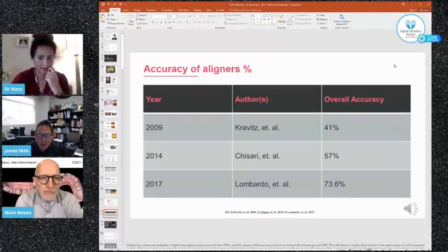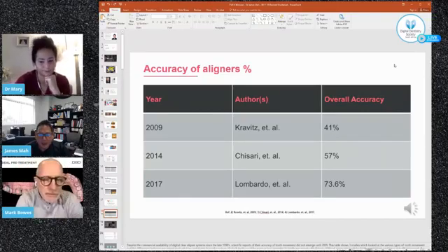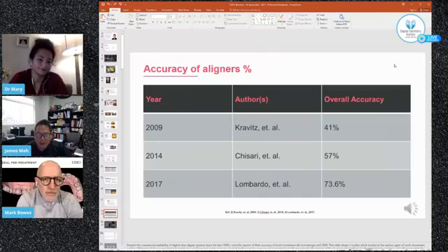Sometimes people have used things like buttons and elastics for that troublesome tooth to help it get to the desired position. But the idea behind why I'm showing this is that originally it was thought that patients simply wore a series and you would get 100% of the way there and everybody's happy. But what happened is the entire profession learned. Along the way, people learned more about staging and said, I know that tooth is going to be difficult, therefore I'm going to overcorrect it, which is a big thing. Or in another case, somebody will say, I'm going to put an attachment on it and increase my success there, or I'm already going to plan for a revision.